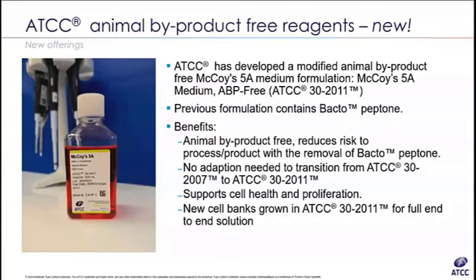Most of the ATCC formulated basal medias contain 1.5 grams per liter of bicarb, which is optimized for 5% CO2 environments. If you're using an alternative DMEM that contains 3.7 grams per liter of bicarbonate, the cells should be incubated in 10% CO2. Increased CO2 is necessary when you're using that higher level of sodium bicarb in order for the buffering to work as appropriate.